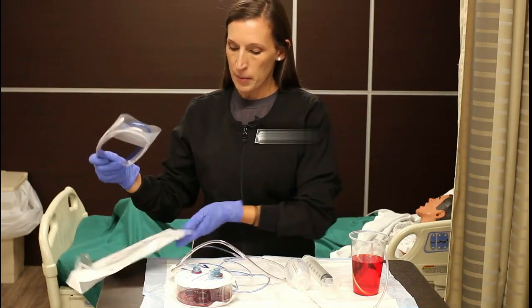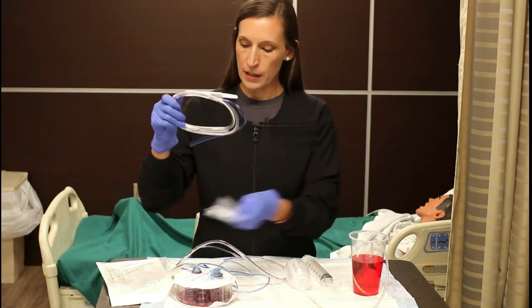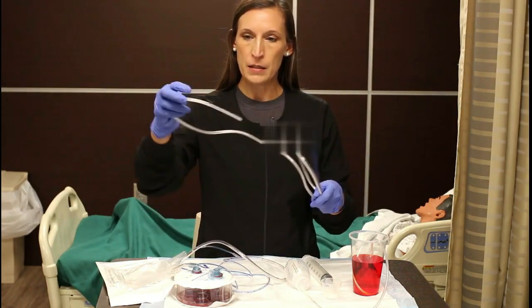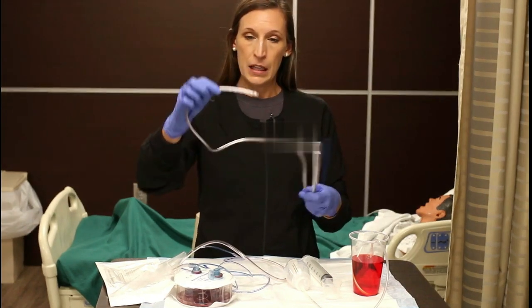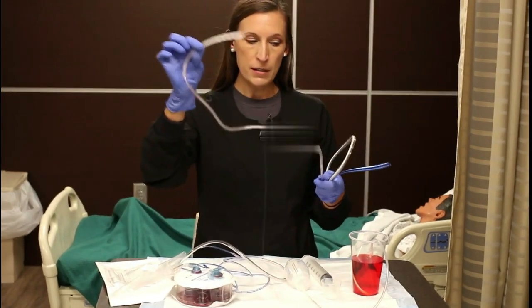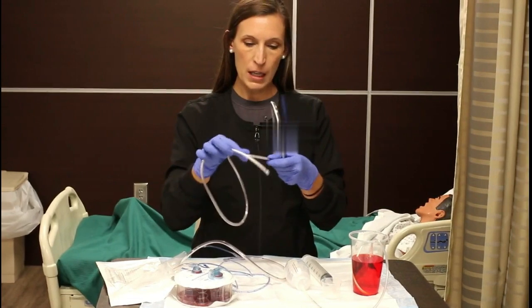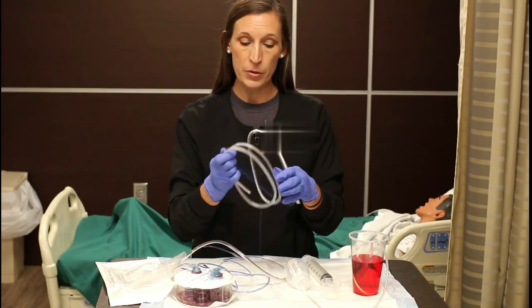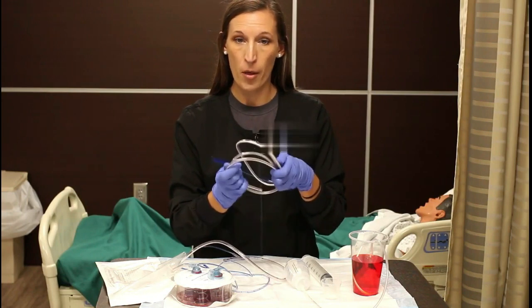You take the tube out of the package and it looks like this. It has little holes at the end — multiple holes — and that's where the fluid gets sucked up from. It has markings. This is a radio-opaque tube, which means when you take an x-ray, it shows up on the x-ray.